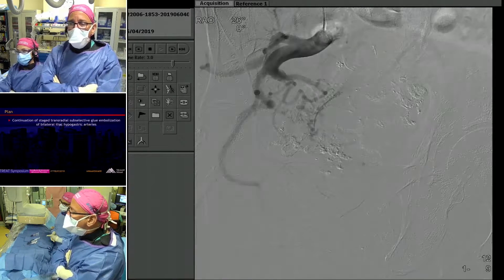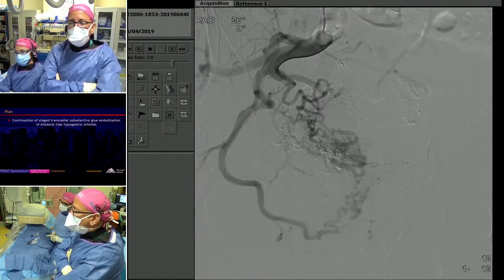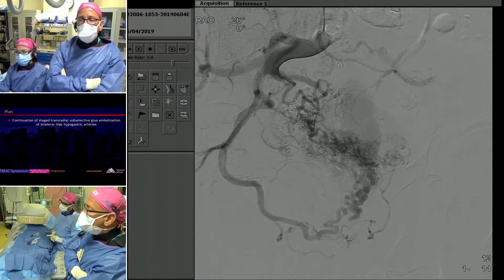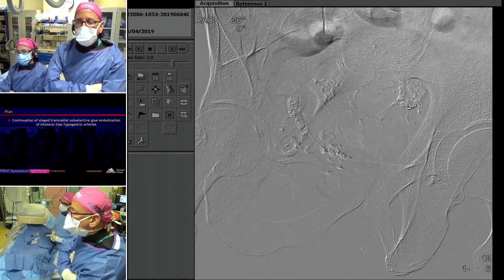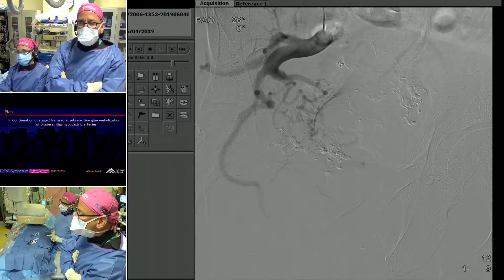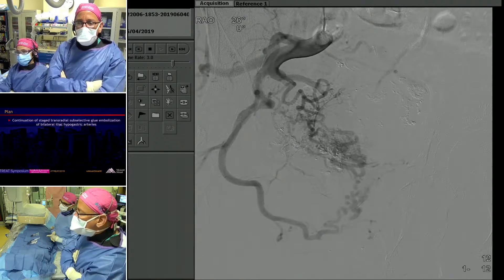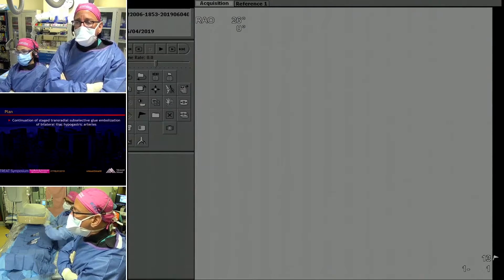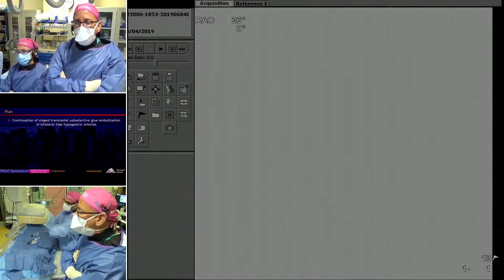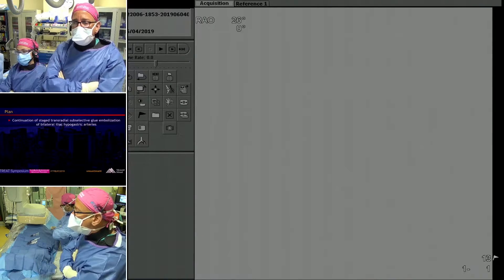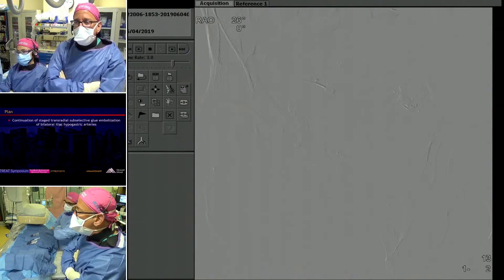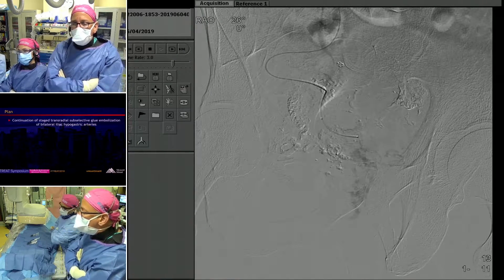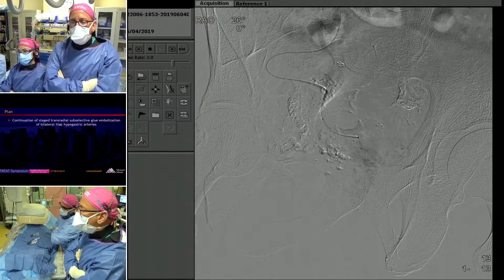We finally decided to regroup. You can see there are a lot of very enlarged anterior branches. We were subsequently able to catheterize a branch which we think is a safe spot to perform a trans-arterial embolization.